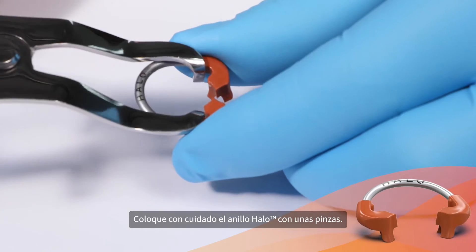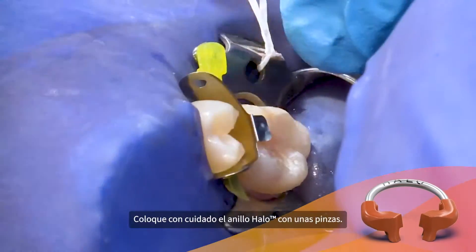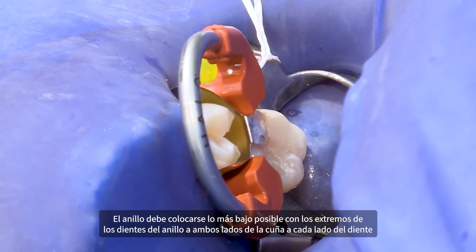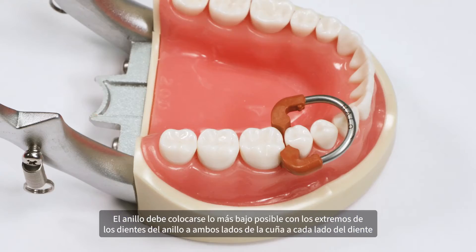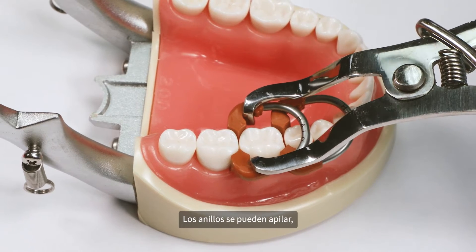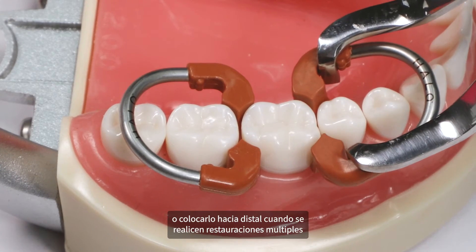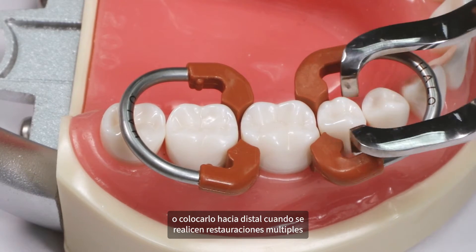Carefully place the HALO ring using forceps. The ring should be placed as low as possible with the tying ends of the ring straddling the wedge on each side of the tooth. Rings can be stacked or configured with one ring toward the distal when performing multiple restorations.